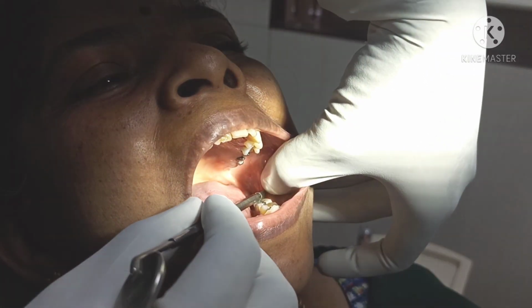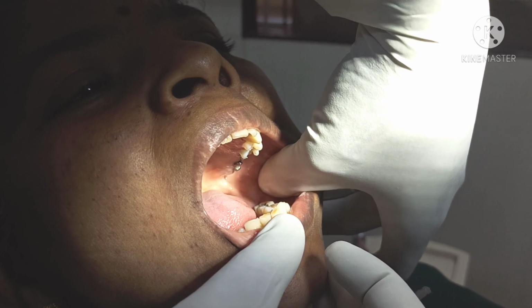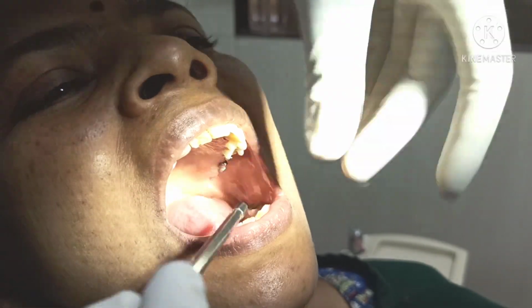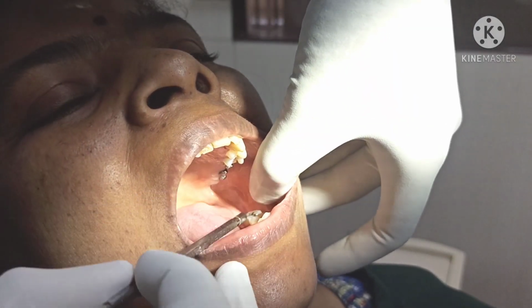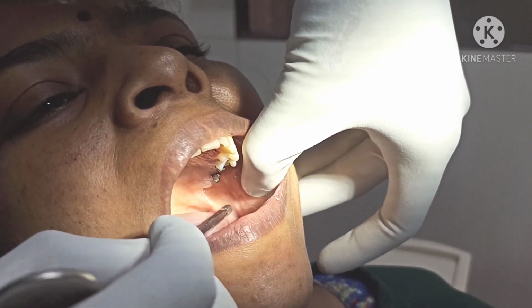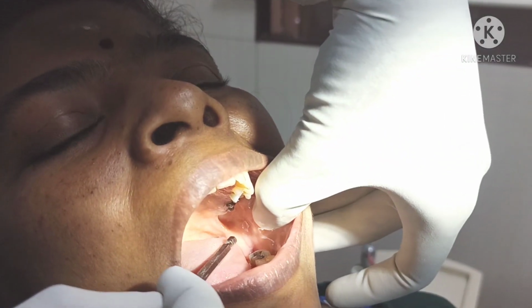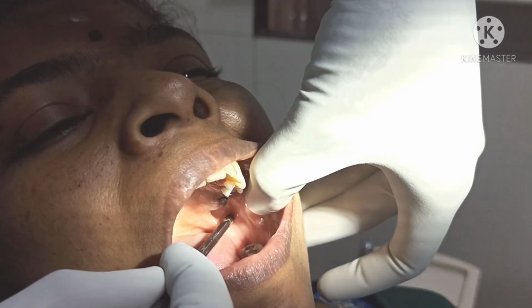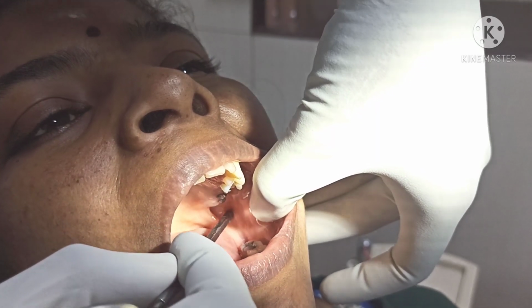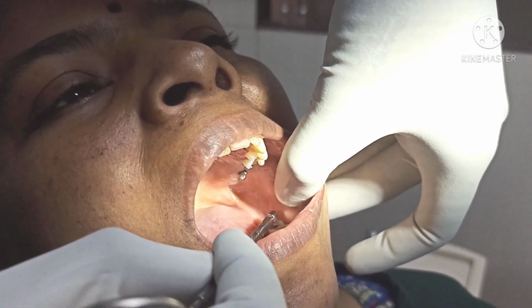The occlusal plane is a landmark, and if you palpate with your thumb the anterior border of the ramus, this is the coronoid notch. Even without palpating, you can give the block. For that we need two landmarks: one is the occlusion plane and the other is the pterygomandibular raphe. This fold which runs from the maxilla to the lower right lingual region is the pterygomandibular raphe. Just anterior to it is our insertion point, and above the occlusion plane about 6 to 10 mm. So our insertion point will be here, just anterior to the raphe and above the occlusion plane.